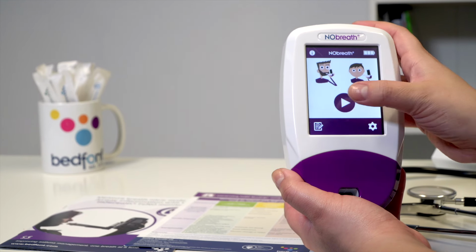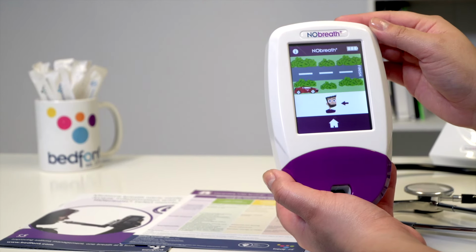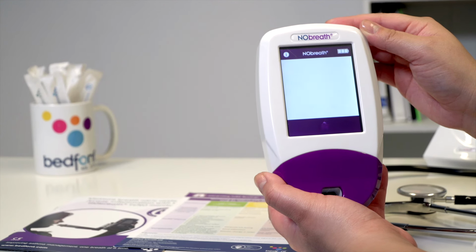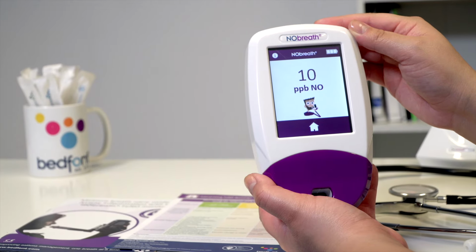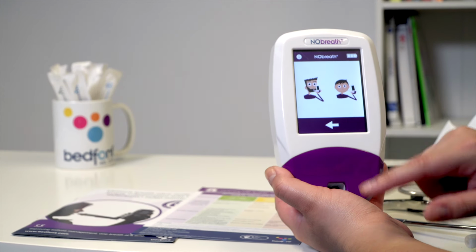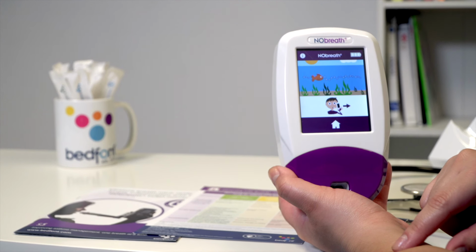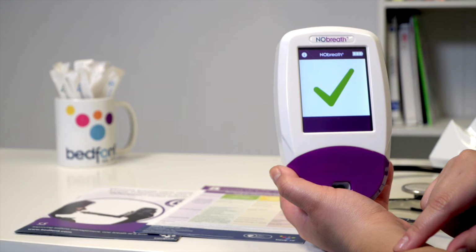The NObreath has an inbuilt demonstration video of the breath test process. We recommend watching this video prior to using the device for the first time. This demo can be used to explain to patients how the test will run prior to performing one. The demo video can be accessed from the home screen by pressing the Play Demo icon. Select either the adult or child breath test icon and a demonstration will begin at an accelerated speed. Press the home icon at any time to exit the demonstration mode.